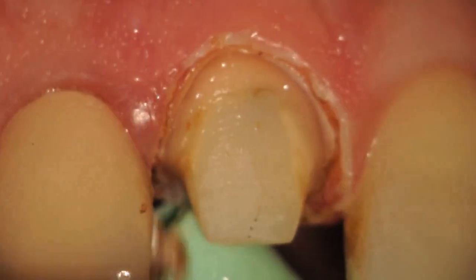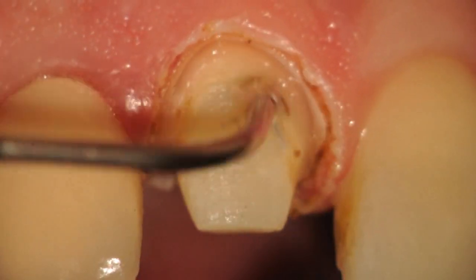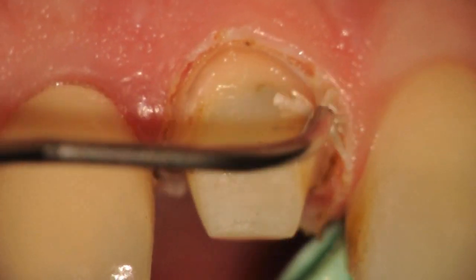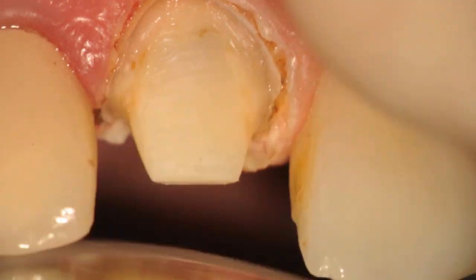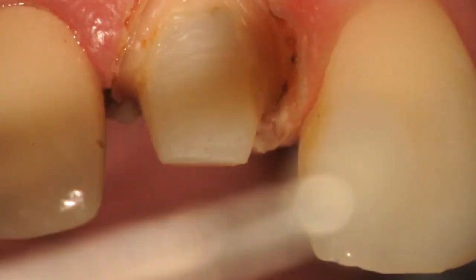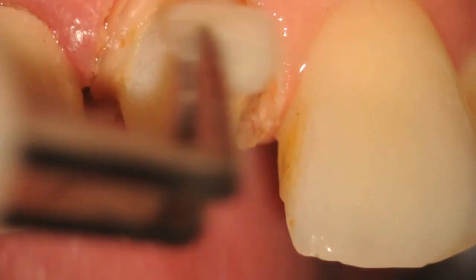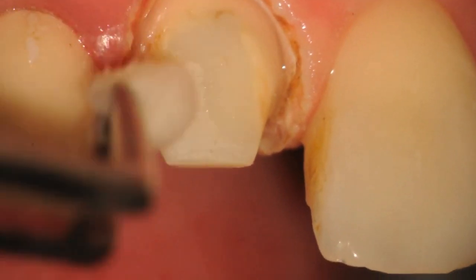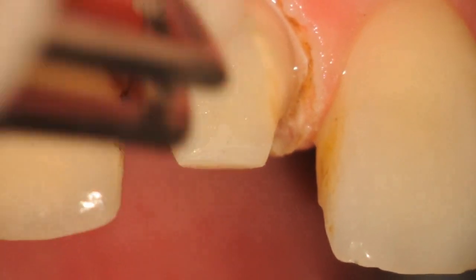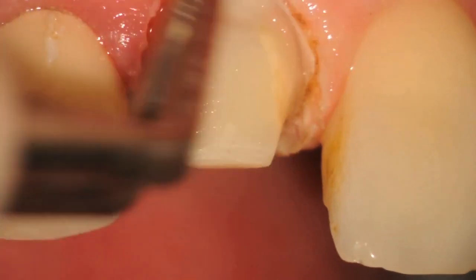After using the hydrogen peroxide, we turn to a wet cotton pellet to again remove any of the white tissue slough at the sulcus. It's just a damp cotton pellet, and we move it around the tissue, typically from the margin away. By doing that, we also distend the sulcus a little bit and remove any loose tissue that is still present.